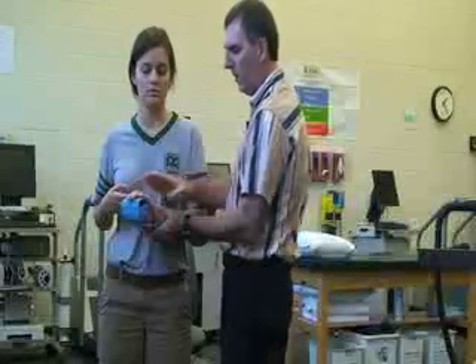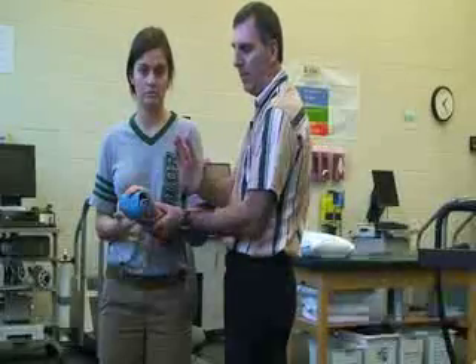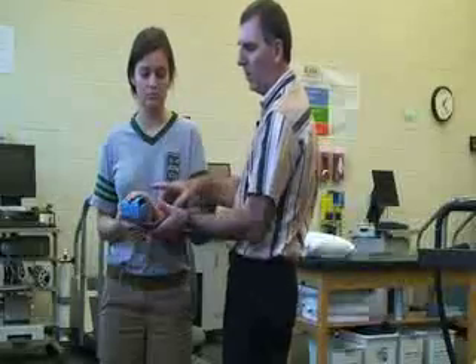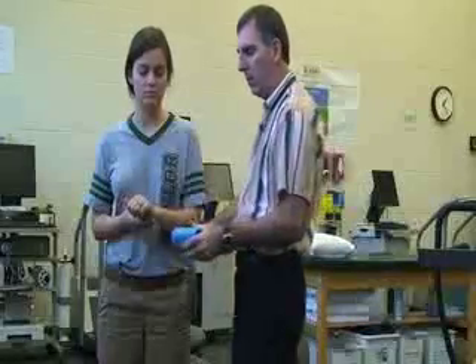You always want to try to splint it in the position found. So if her hand is in that position, and if I need to make some adjustments, I would need to do that on my own before I apply it for a final time.